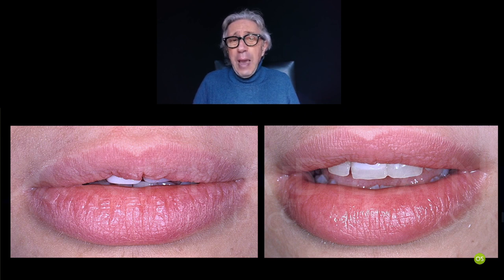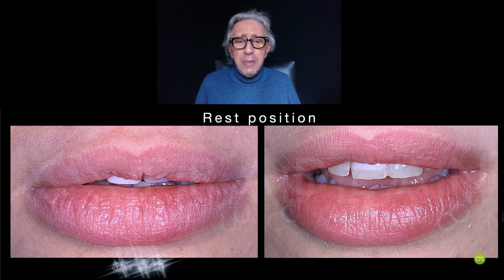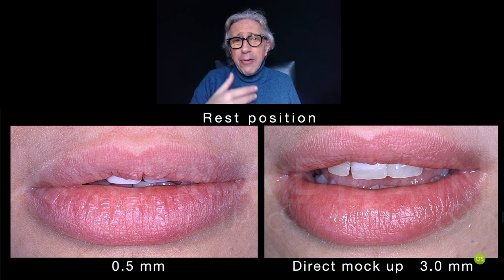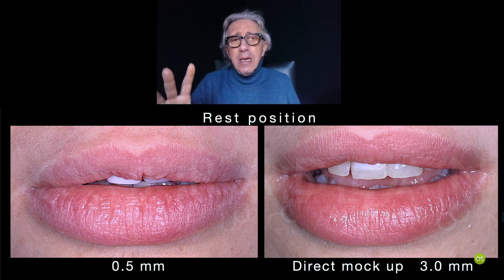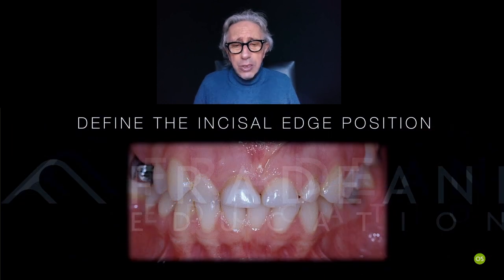The teeth are just 5.5 millimeters long, very short. We have added 2 millimeters, 2.5, and now we have 3 millimeters of visibility. That is nice. From 5.5 millimeter length, now we have 8 millimeters, but still not 10.5, 11 as normal. Normally central incisor length is between 10.5 and 11 millimeters. We have just 8 millimeters. So at this point, we have done this mock-up very rapidly, not refined, just to have an idea of how we can obtain the lengthening of these teeth, how much it should be.